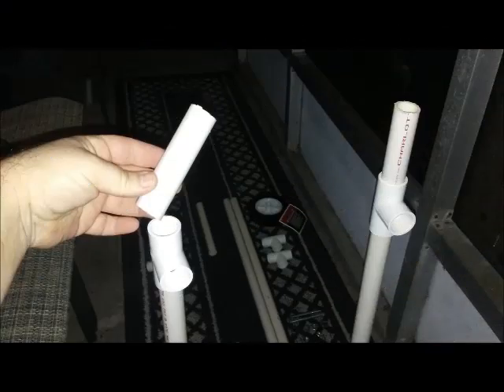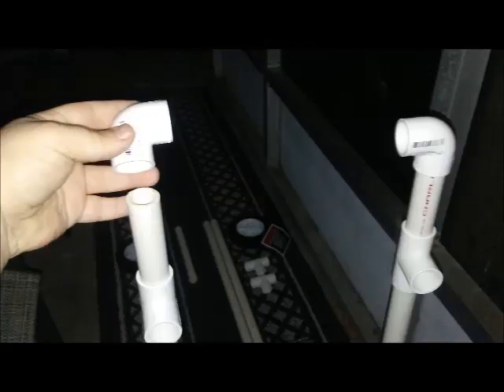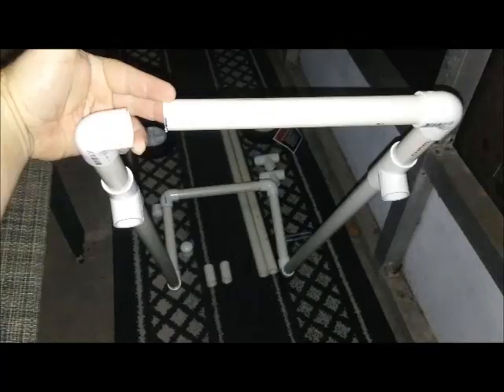At the end of that, put two number five T-connectors, and then two of the number seven three-inch pieces at the end of those, followed by two more number four elbow connectors.